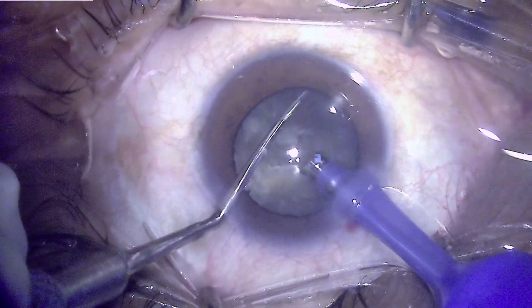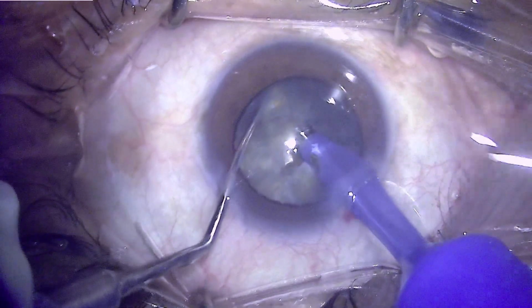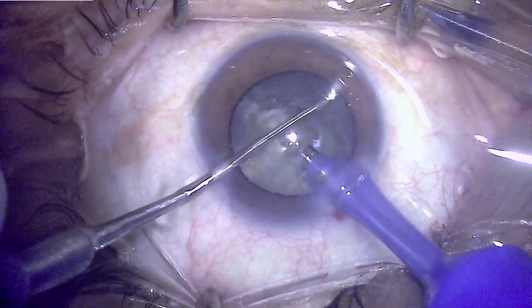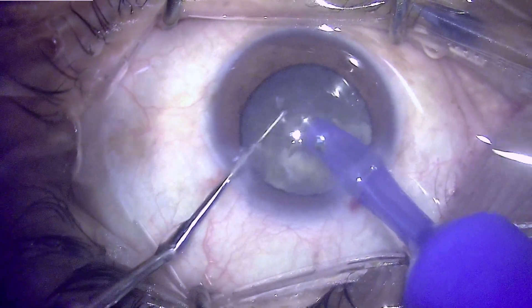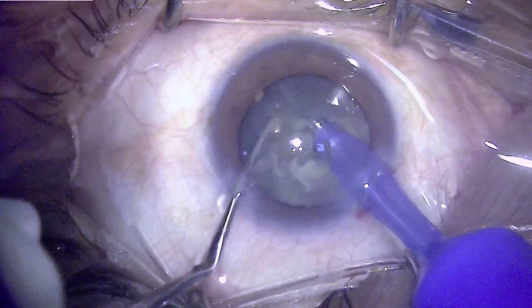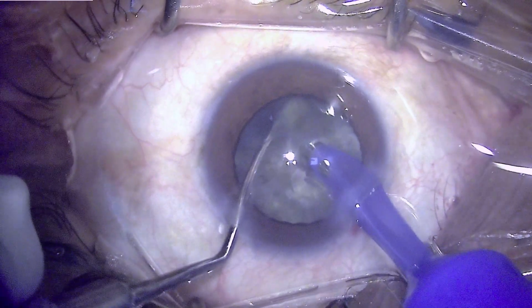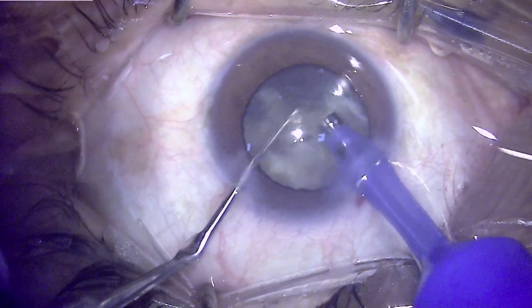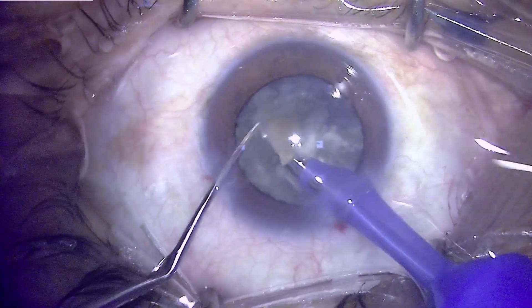...or maybe even more, so that the pieces are small enough to be manipulated and consumed by the phaco tip, we switch to the power modulation mode. This not only allows proper consumption of these pieces but also prevents chatter. Here we are using a multi-chop mode, chopping the nucleus into multiple small pieces — usually more than four, maybe five, six, seven, or eight — and then we switch to the power modulation mode.